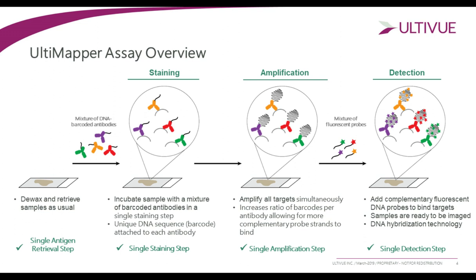This is important because this actually allows you to have a very quantifiable type assay, where these targets are amplified to a rate where you can really go ahead and see differential expression of a particular marker. High and a low expressor, for example, are very clear to see. And it's easy to compare markers in different channels. So you could compare your CD4 expression to your CD8 expression, for example, based on relative expression, because all targets were amplified at the same rate, same time, in a linear amplification methodology.